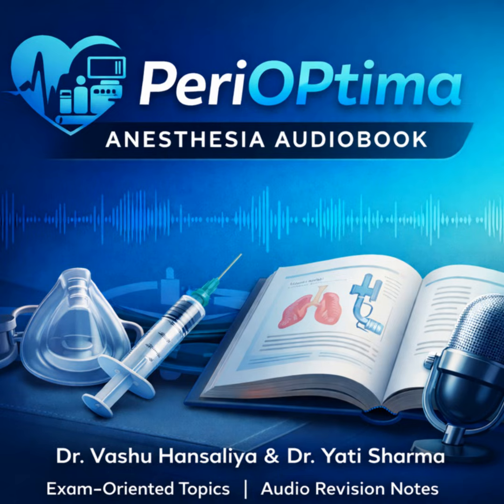Okay, let's move on to technique. The technique of direct laryngoscopy is a foundational skill, and it all starts with positioning. Positioning is half the battle won before you even start. The goal is simple. You want to bring the oral, pharyngeal, and laryngeal axes into alignment. And we achieve that with the sniffing position. The famous sniffing position. It involves two distinct movements. First, you need flexion of the lower cervical spine. You get that by placing a small, firm pillow under the patient's head. And then you have extension of the head at the atlanto-occipital joint.